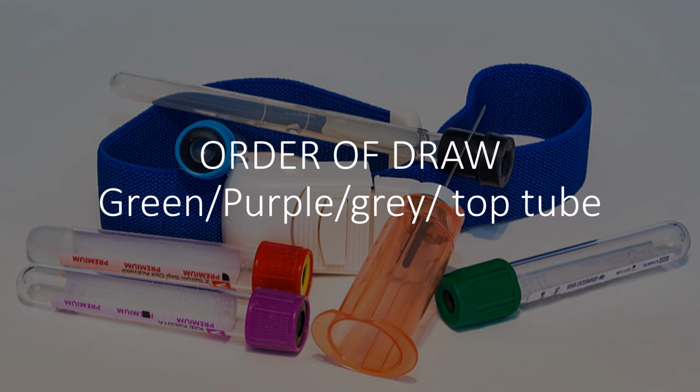Now remember, that's going to be on the label of your tube, and you want to know that before you get started, because if you're doing a chemistry profile that has sodium in it, you would not want to use the heparin sodium, because it will falsely elevate our sodium, right? Because if there's sodium already in the tube and we're testing for sodium, we don't want that in there, because it'll give us a falsely elevated sodium, right? And we'll have invalid test results.